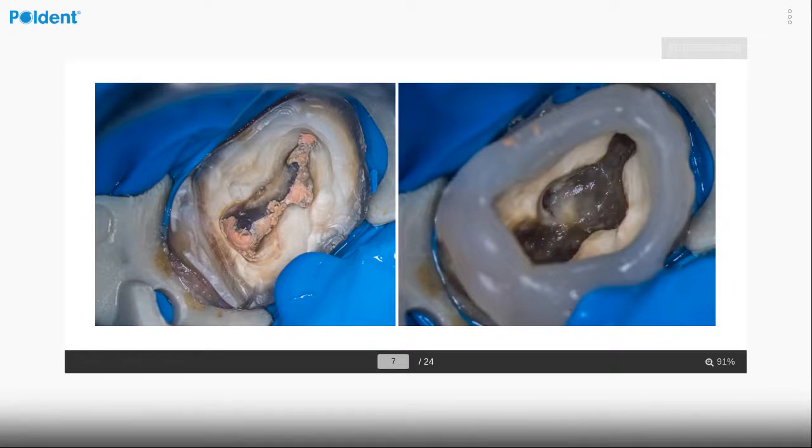You can see the transformation of the look of the pulp chamber after removing a huge amount of dentin, actually, between the MB1 and MB2 canal. There is a small isthmus, which is calcified, and the space we need to remove is located far away, at the mesial wall, before the line which connects MB1 and the palatal canal. This is the place where we always search for the MB2.